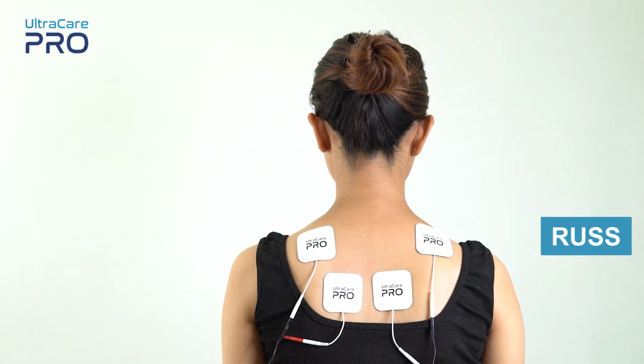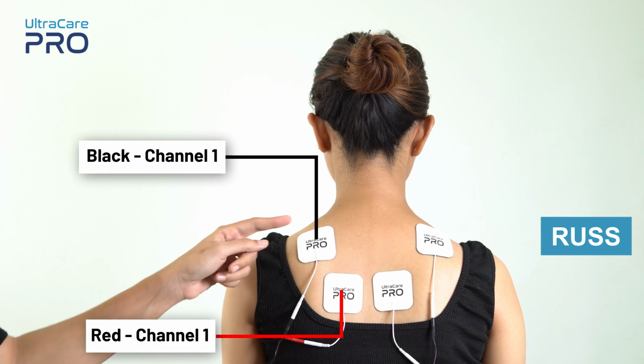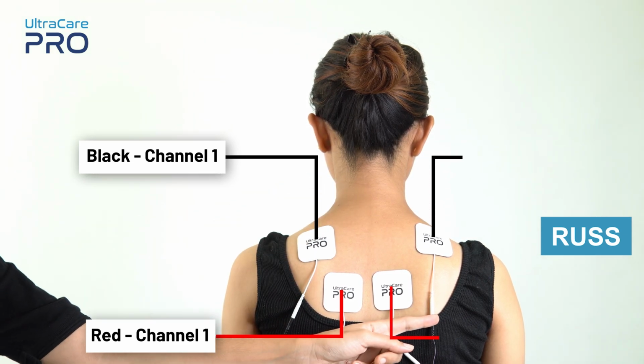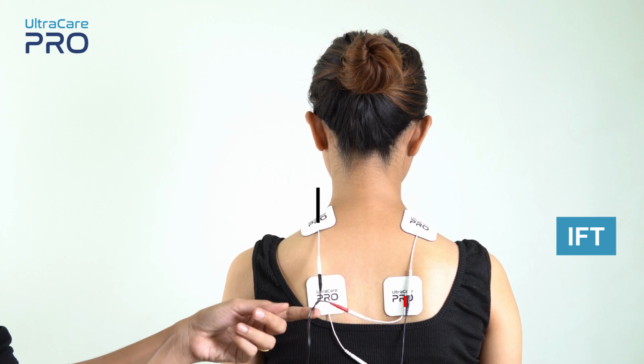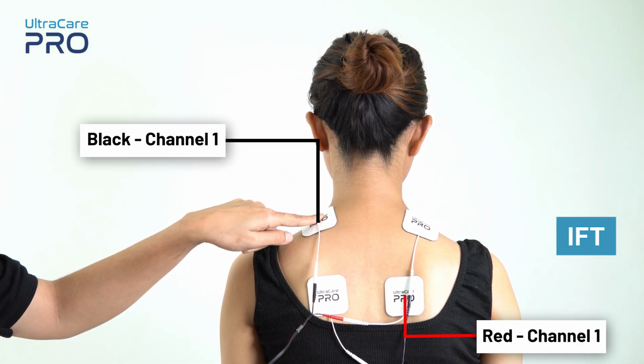For Russian current application, place red and black wire on the muscle that needs to be stimulated from channel 1. Similarly, place red and black wire on channel 2 on right hand side over the muscle that needs to be stimulated.